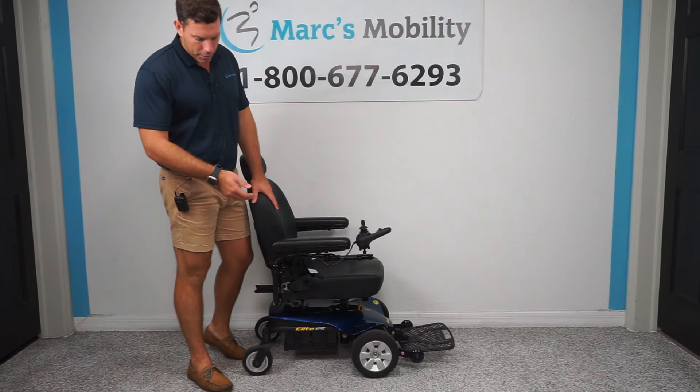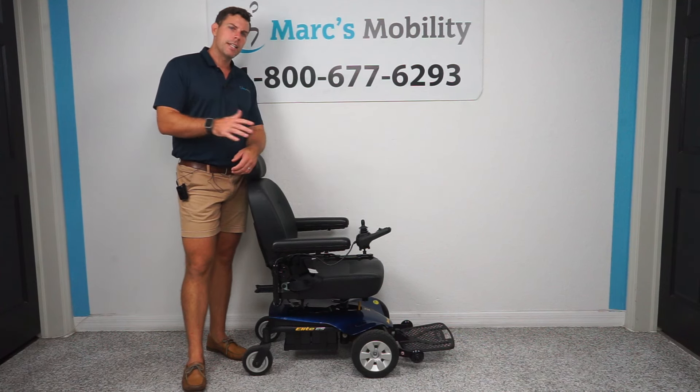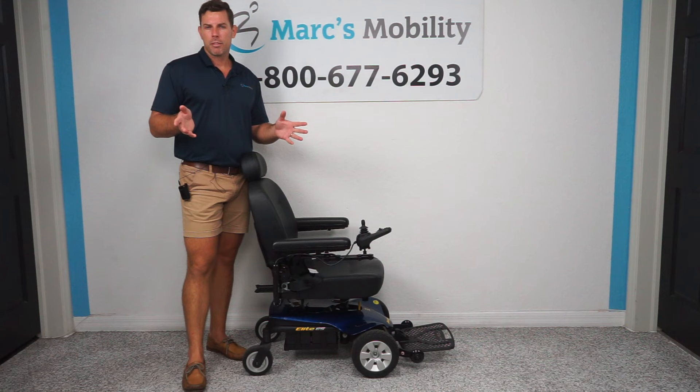This unit comes with 35 amp batteries, called U1 batteries. If you need batteries for this chair or any other power chair or scooter, give us a call — we can typically ship them to your driveway at the same price as finding them locally, in about three to four business days.